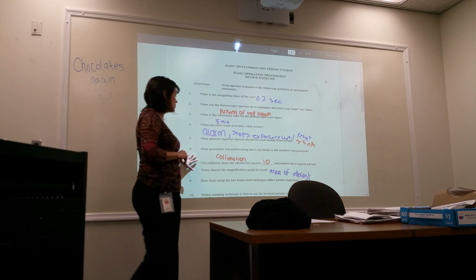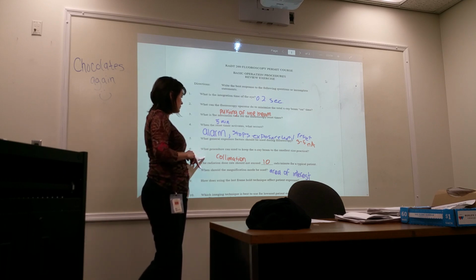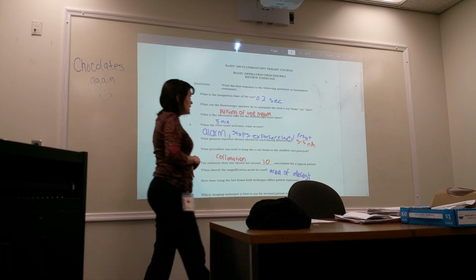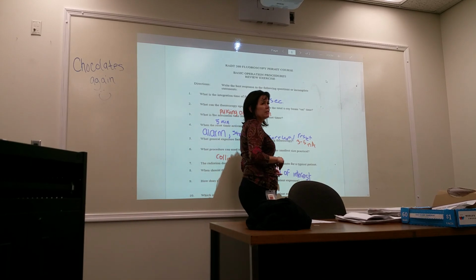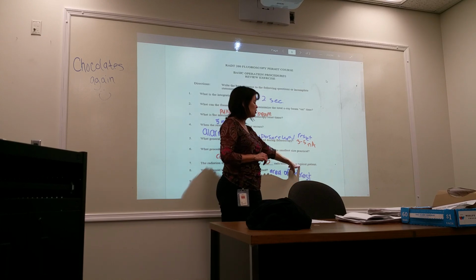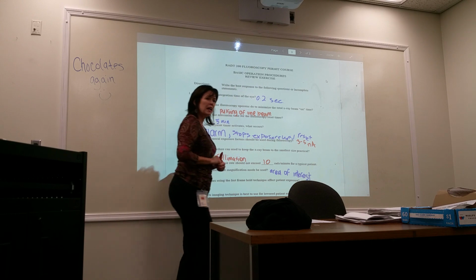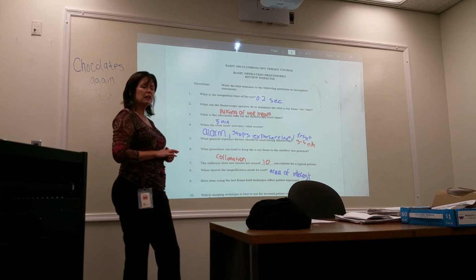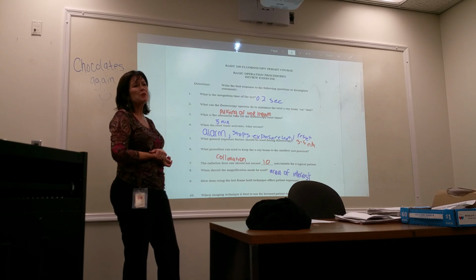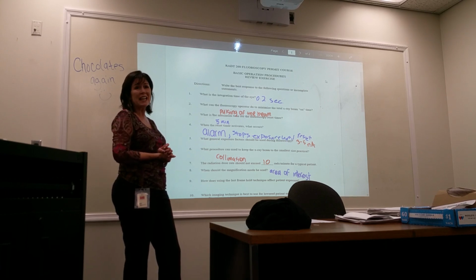What procedure can be used to keep the X-ray beam collimated? The radiation dose should not be... This is a true statement, but what makes this answer incorrect is this word right here. We certainly didn't talk about it tonight, but let's review. Do you remember the 5 R per minute, the 10 R per minute, with and without the AEC?